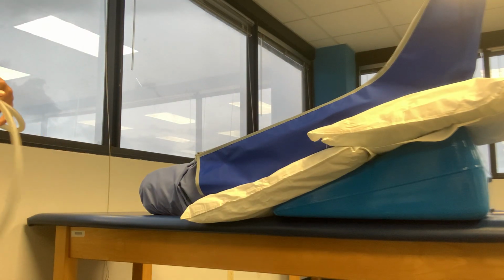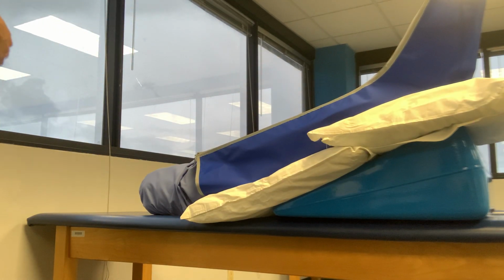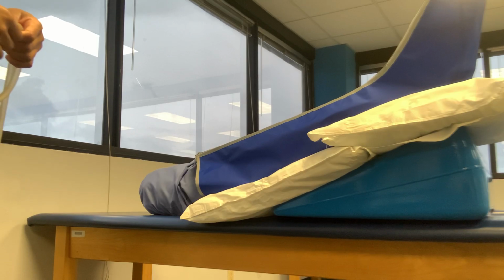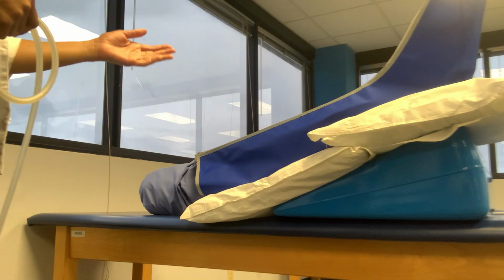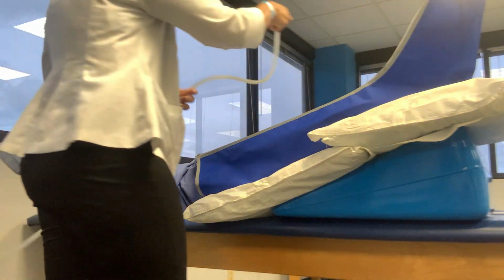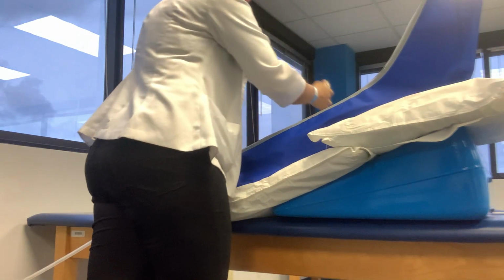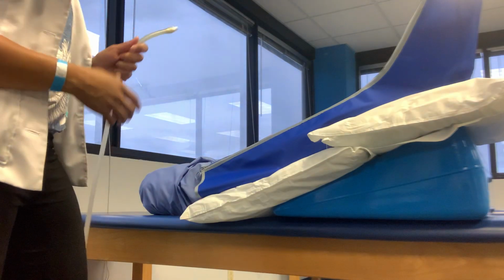So what you want to be mindful of is when you get your case, you want to think about where the machines are located, because more than likely the machines themselves won't be able to be moved, but where the machine is located, what side of the body that you will be treating, so that you make sure that the limb that you're treating is closest to the machine, because you don't want to have the hoses move over your patient in order to be attached, right?